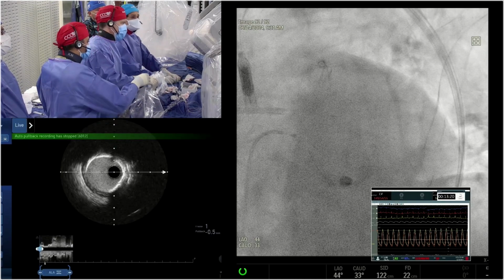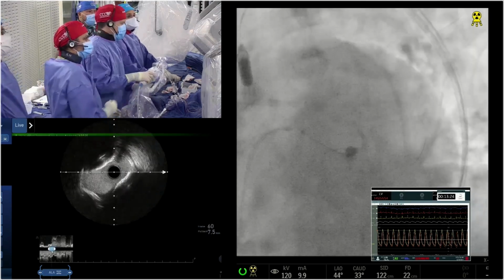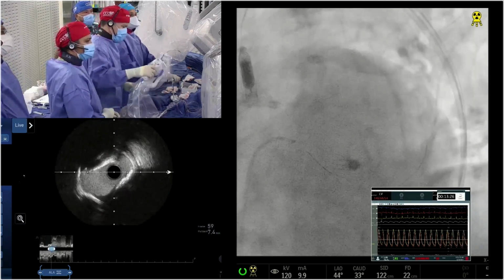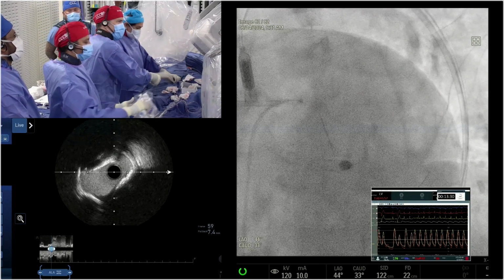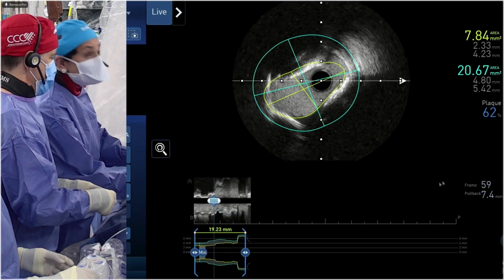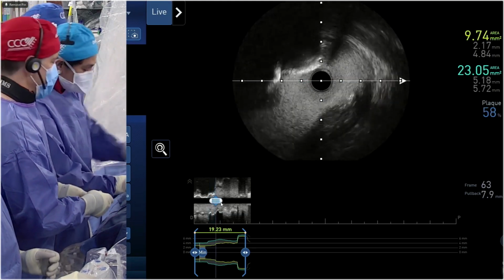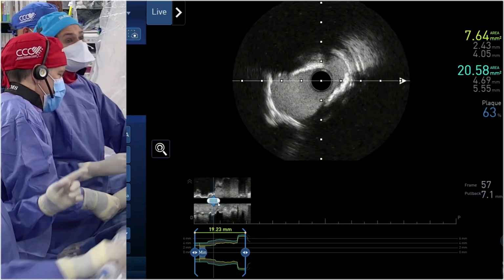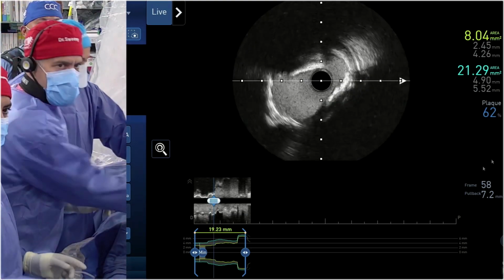Okay, go back and show what happened to our nodule. I feel like it looks somewhat similar. Go back, there are fractures there. You'll see it on the top part. There was a decent amount of fractures. Look at that, it's actually cracked right there. A little bit of a crack. I see it right there at around 12 o'clock.